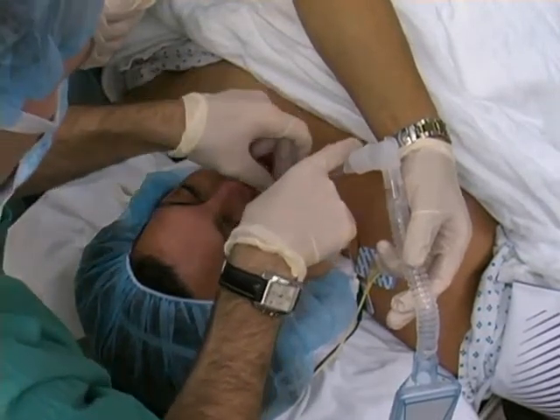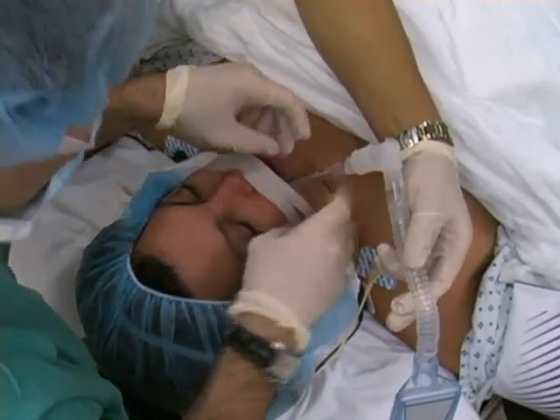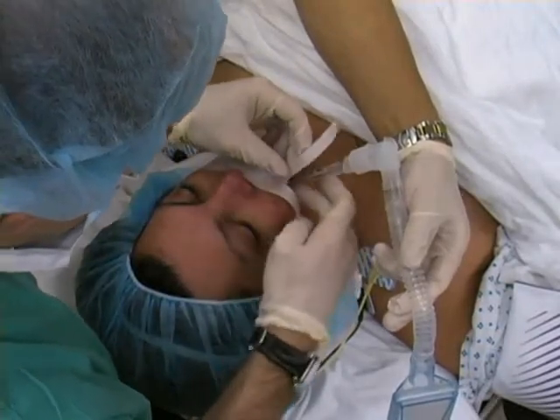Secure the tube with tape, fixing the tape to the patient's cheek and upper lip around the endotracheal tube, and again to the upper lip and opposite cheek.